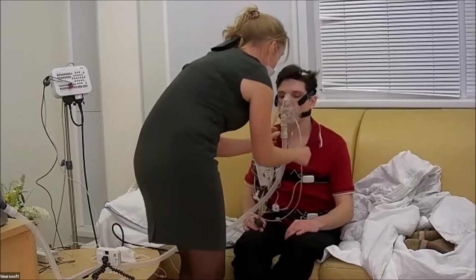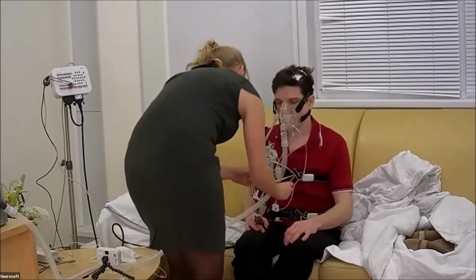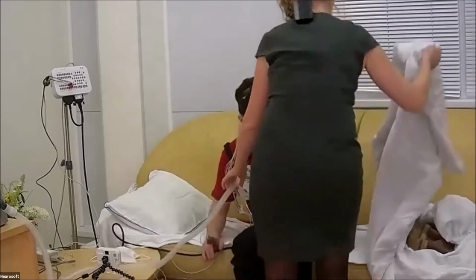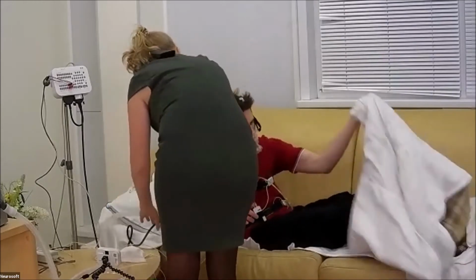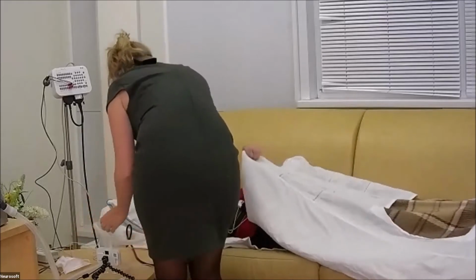Is that okay? Yeah. So I connect the tube to the pressure sensor. Now we ask our patient to lie down. Is that okay? Okay.